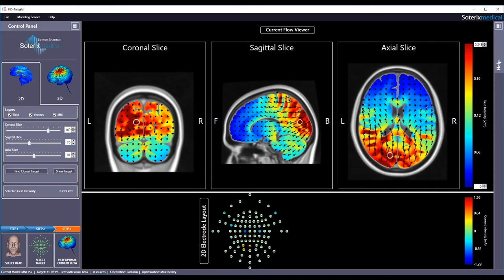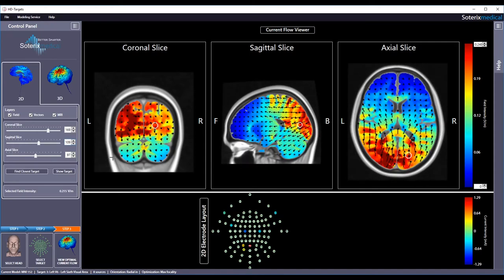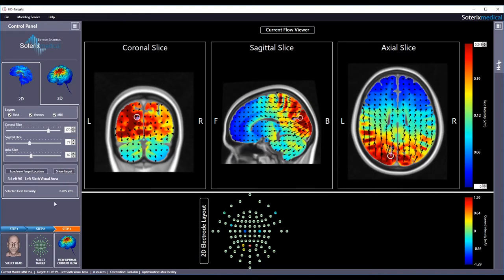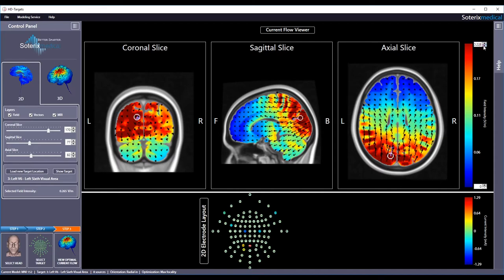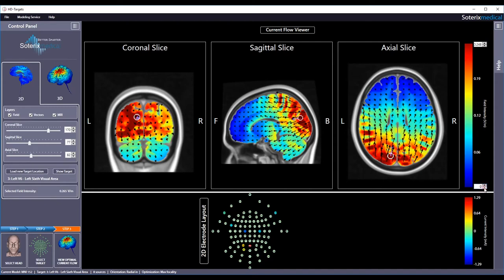If you are interested in again visualizing the target and the induced current flow, simply hit show target. The field intensity scale can also be adjusted as needed using the buttons at the top and bottom of the bar to better depict current flow patterns. Note that the optimized electrode placement is shown in the bottom and the chosen optimization parameters like the target and the chosen constraints are listed for reference.